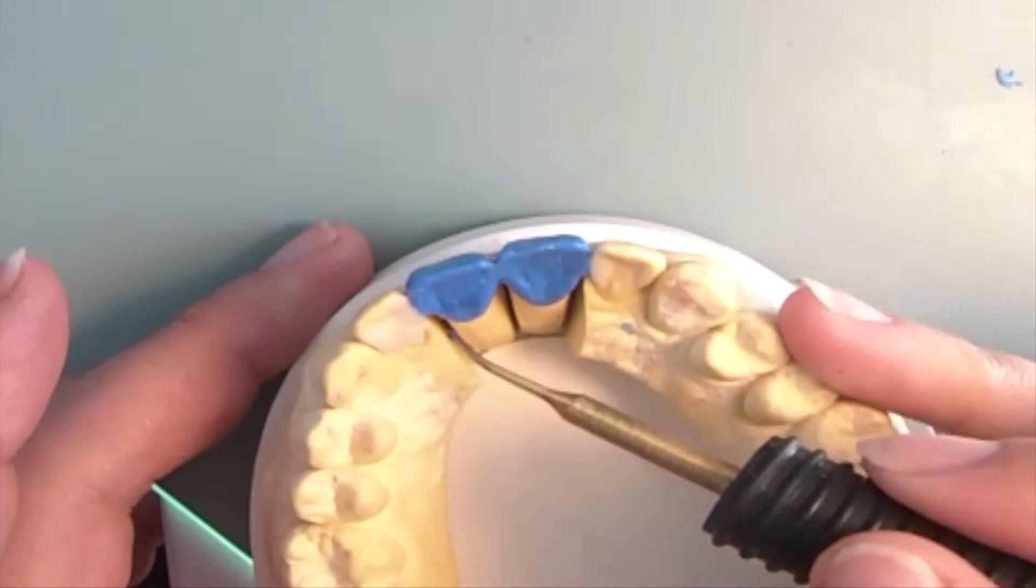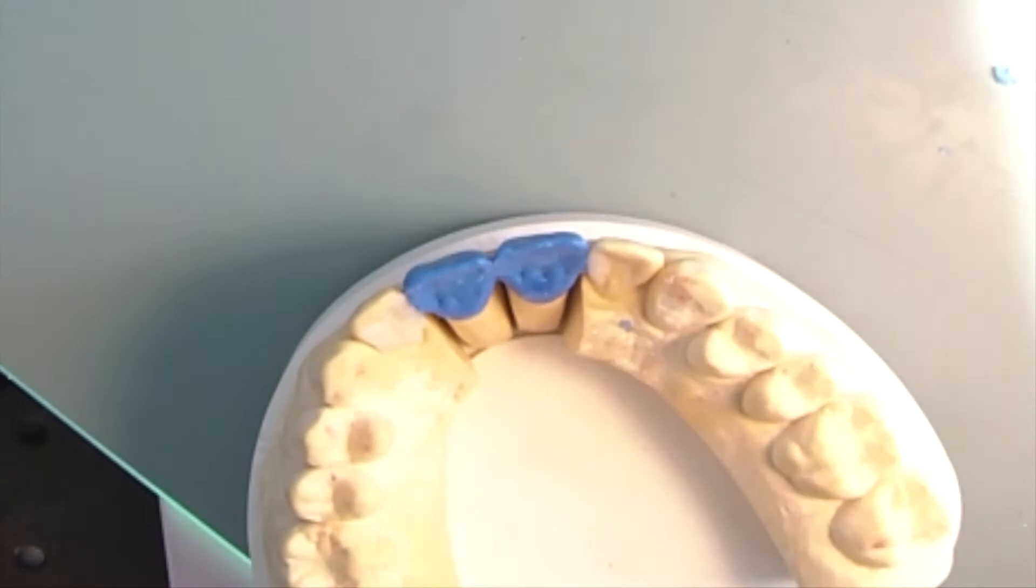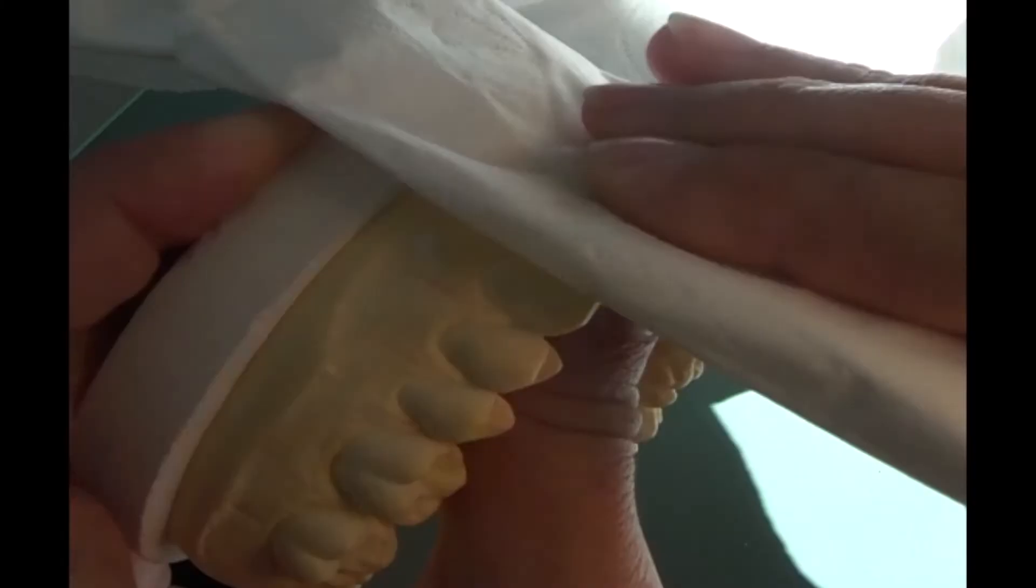Before we start with the finishing, I show you my trick for a smooth surface. I take a paper towel with oil and polish the surface.